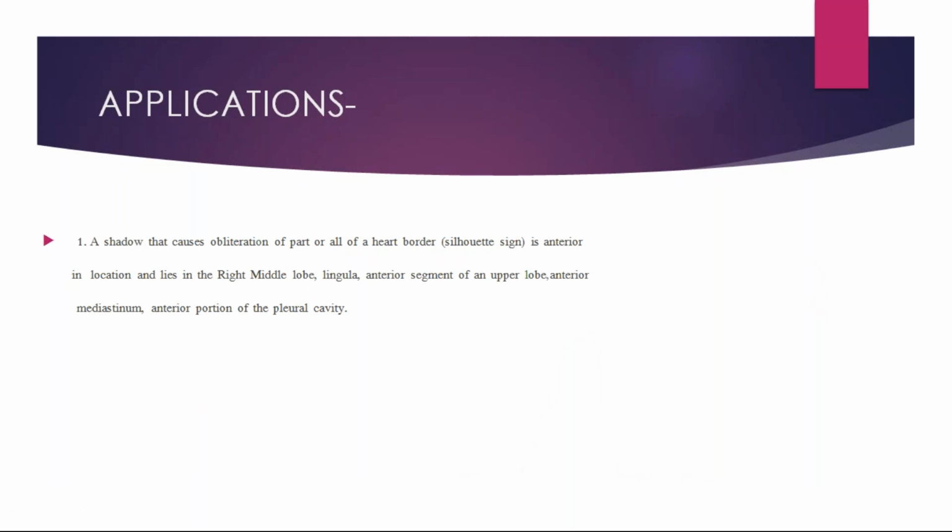And now coming to the applications, a shadow that causes obliteration of part or all of a heart border is anterior in location and lies in the middle lobe, lingula, anterior segment of the upper lobe, anterior mediastinum, or anterior portion of the pleural cavity.